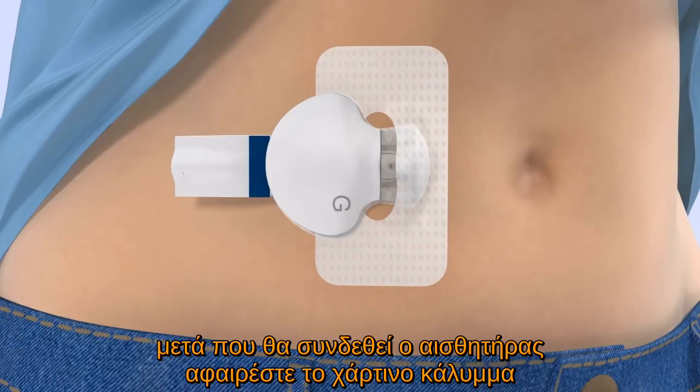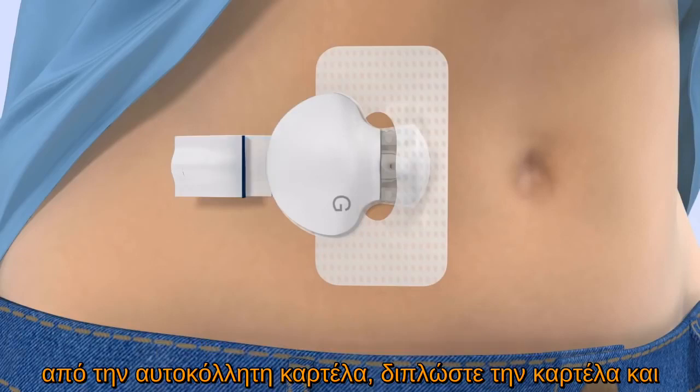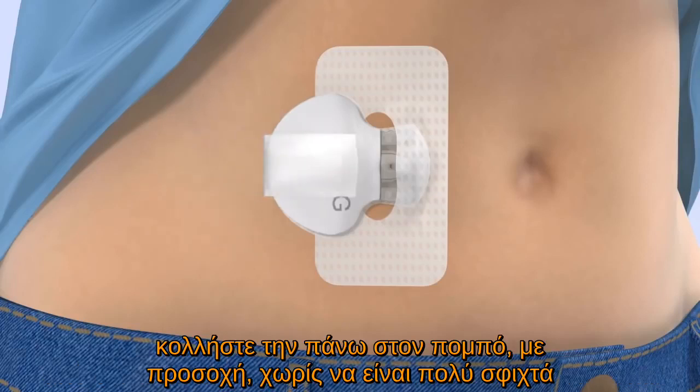Once the transmitter is connected, remove the adhesive liner from the adhesive tab, fold the adhesive tab over and stick it on the transmitter. Be careful not to pull the adhesive tab too tightly.